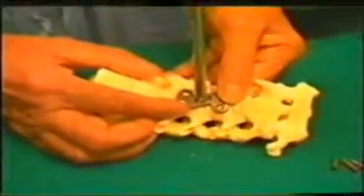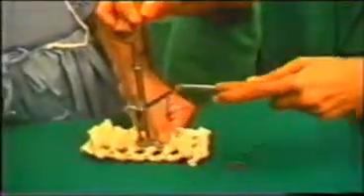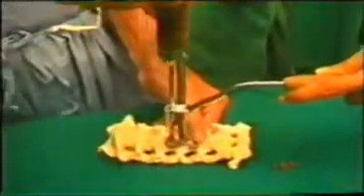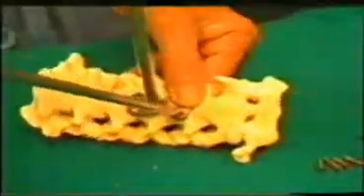Now the holes will be made at the lower end. This is the guide and this is the drill, and it will drill the hole. Once each hole is complete, you put the next one. Once the direction has been established, you really don't require the guide anymore, and you tap the hole in the direction that has already been made.